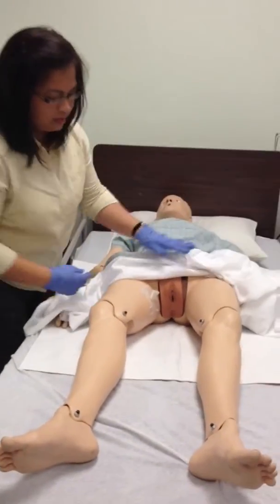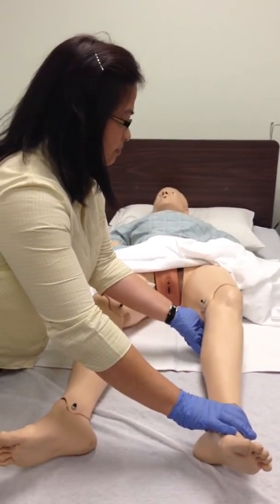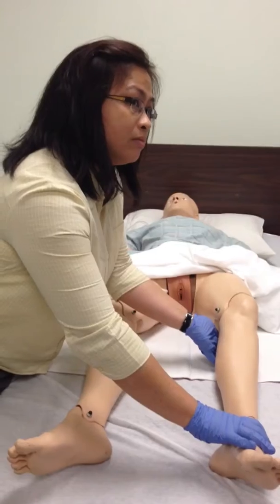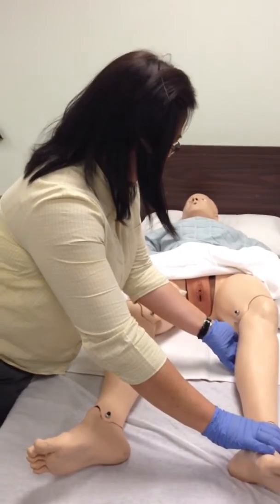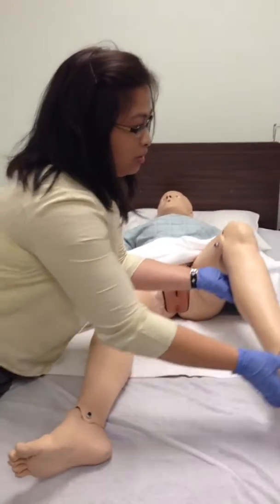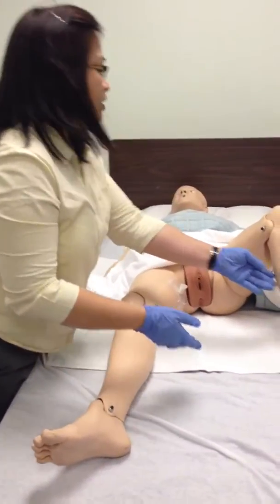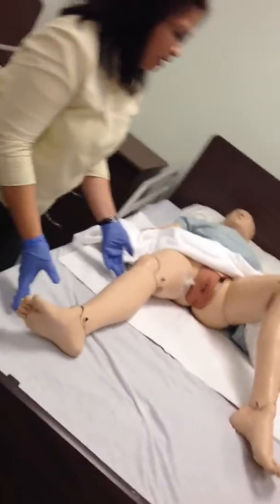And then you're gonna go and... Is that when you do assessment of the vagina to see if there's any lesions or things like that? Yeah, you can do that also because you're there already. You're doing assessment already right now. Okay, you're gonna position the legs, okay?